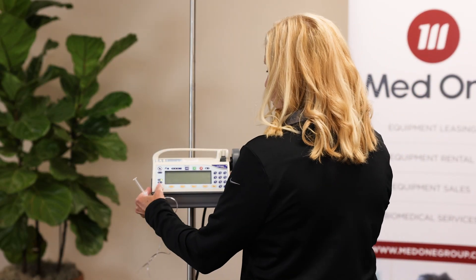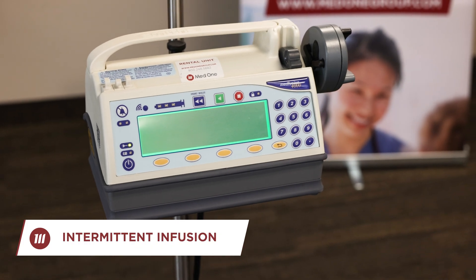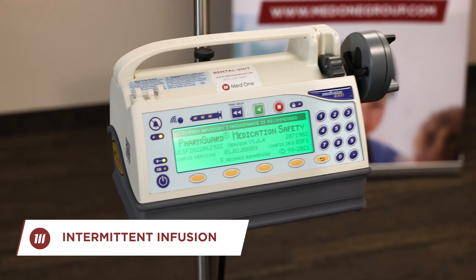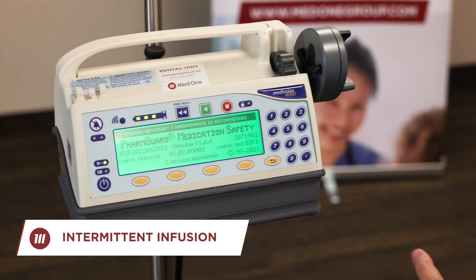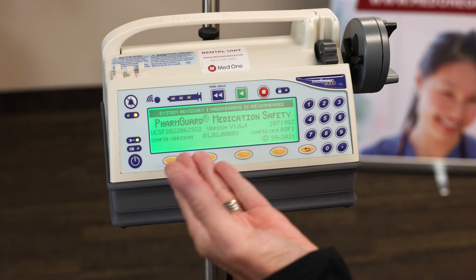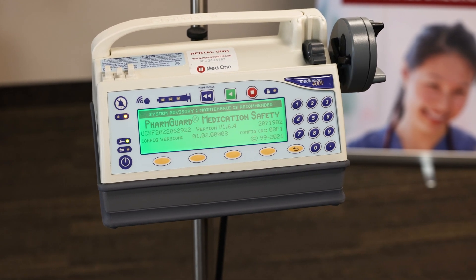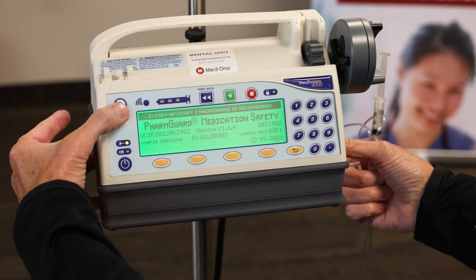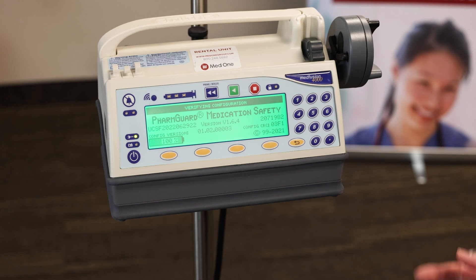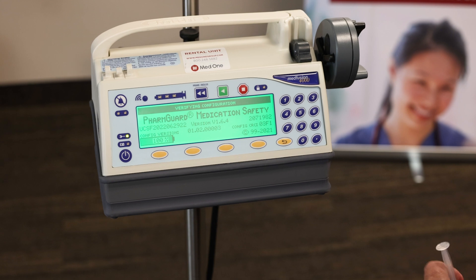So first of all, I'm going to push my power on button, and it goes through some diagnostics. This is an alert that you might see from time to time — it's saying that maintenance is recommended. You simply press the silence button. You're still able to program the device; after you use it, I would recommend tagging it and sending it on down to Biomed.